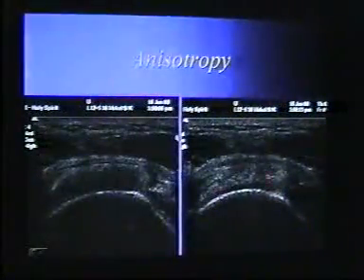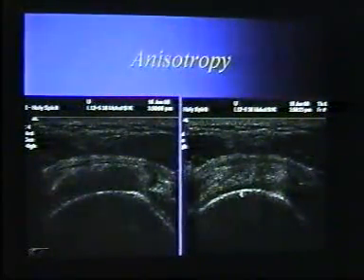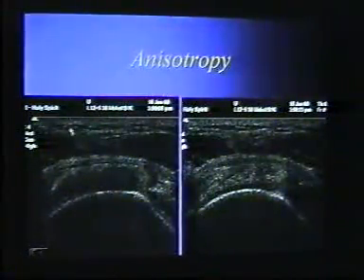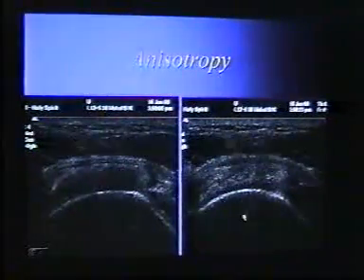Here we have a tendon. It is Achilles tendon. In longitudinal direction we can see the bundles, and there is no tendon sheath. Extensor pollicis longus, the tendon, and then there is tendon sheath. There is peritendinosis. Again tendons with anisotropy. This is anisotropy. It is an artifact. When we change the angle, we will get that it is normal. Other tendons in the shoulder joint.